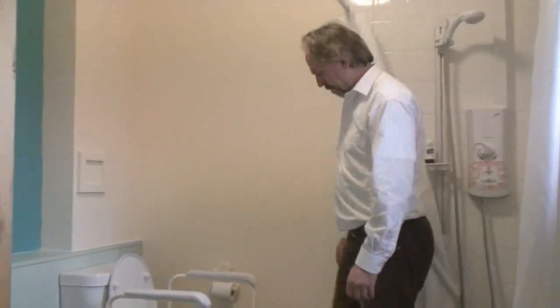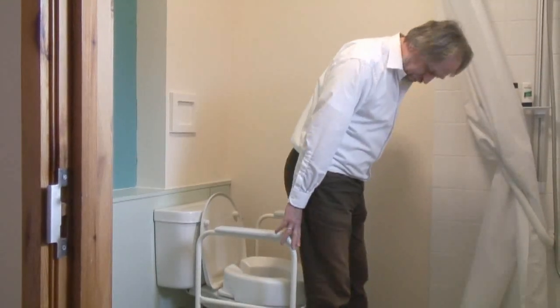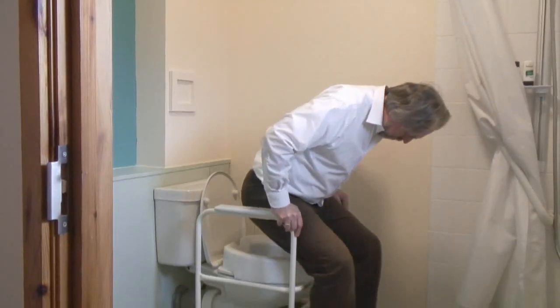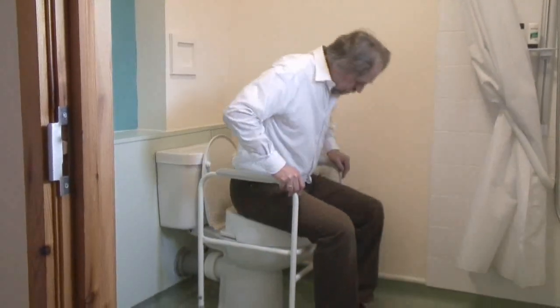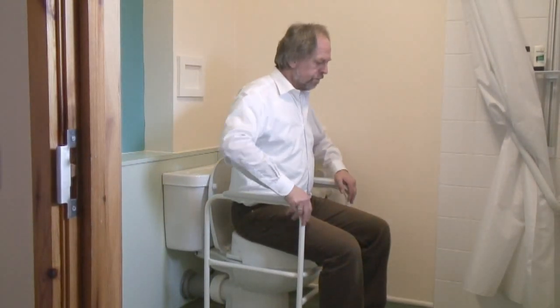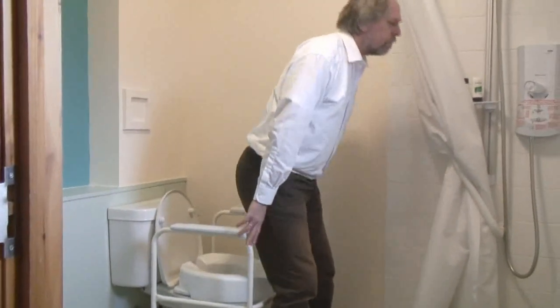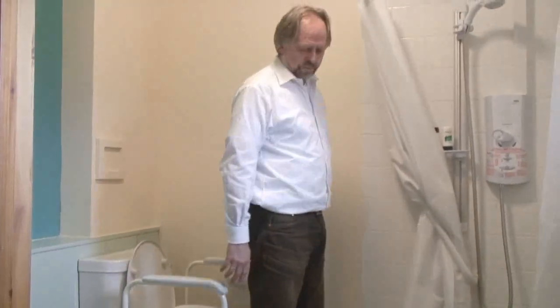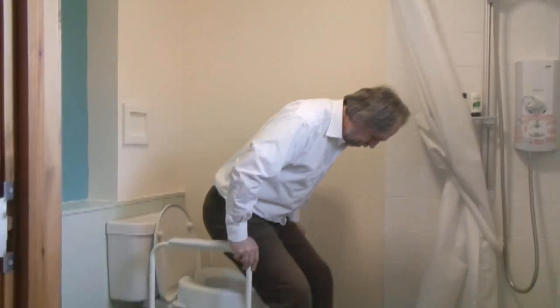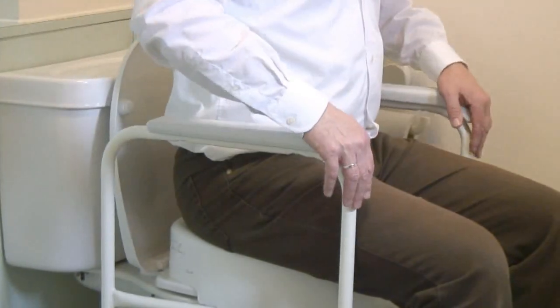Just another option here, Charles. If you're either not keen or you're not sure how well you can fit a rail to your wall, these kind of toilet frames fit over your existing toilet and can be used with or without a raised toilet seat. They can just give you that extra bit of support. The advantage to these is that they give you support on either side, which gives you that bit more purchase as you're demonstrating to get up and down from the toilet. These are readily available on the market. Most of them are adjustable in both height and width, which will allow them to fit to most toilets and most bathrooms.